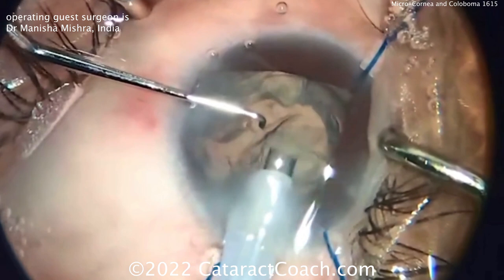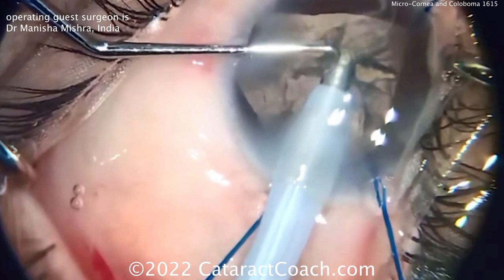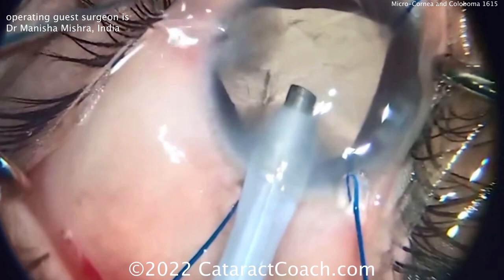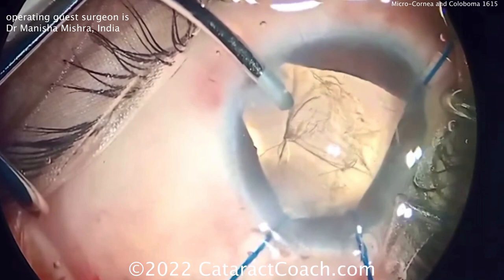The question is: do you suture the iris coloboma? I think the answer is typically not really — patients are used to this, that's how the pupils function for the patient, and you want to avoid doing too much in this case. Removing the lens material here — looks like a little epinuclear shell coming out, and that goes in quite easily. Now let's examine the capsular bag.